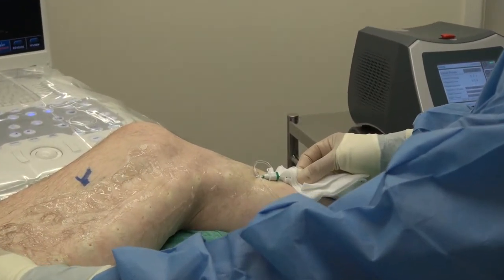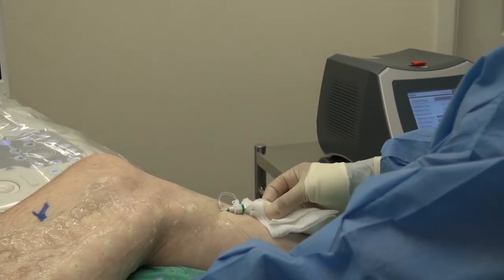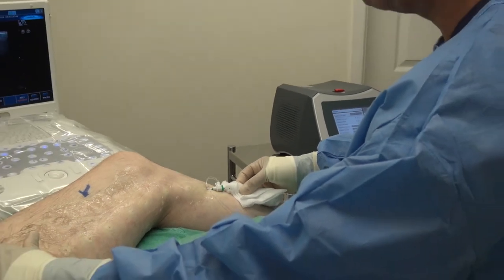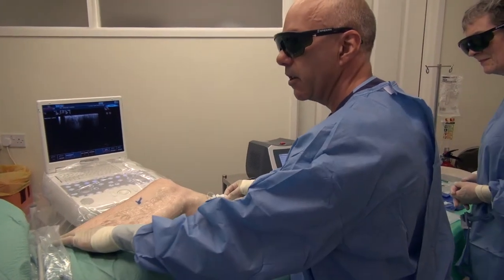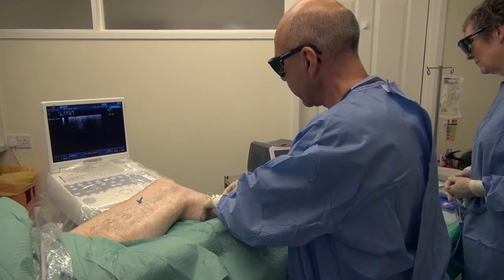You might feel at the beginning of the procedure a little crackle in your thigh. I describe it sometimes as sitting on a bag of crisps — that sort of feeling. It shouldn't be painful, but if I don't tell you about it, it might give you a startle. Right at the beginning, you might feel a little pop and crackle. You might feel nothing at all.